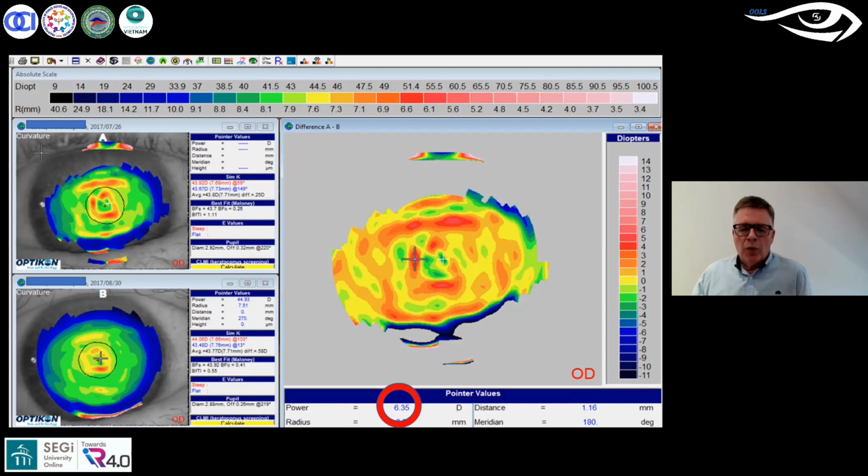But we've not touched on one aspect of corneal topography, which I think was my main reason for exploring the instrument, and that is orthokeratology. So I'm going to finish now with a slide which amuses me a little bit.